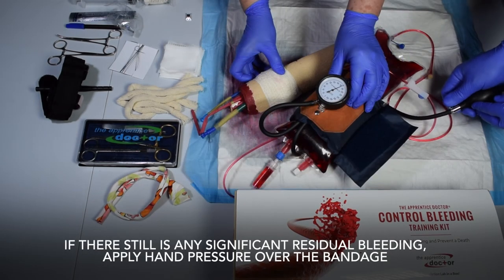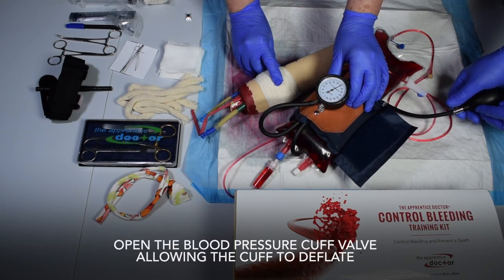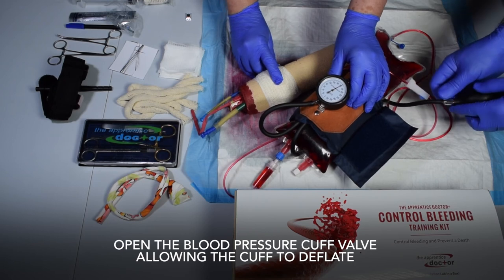If there still is any significant residual bleeding, apply hand pressure over the bandage. Open the blood pressure cuff valve, allowing the cuff to deflate.